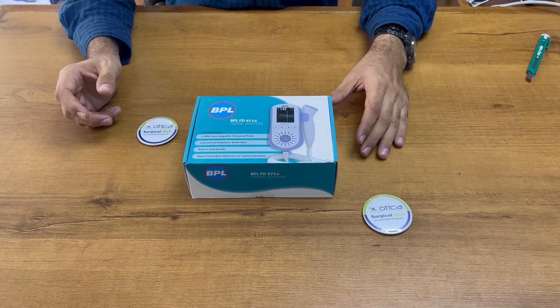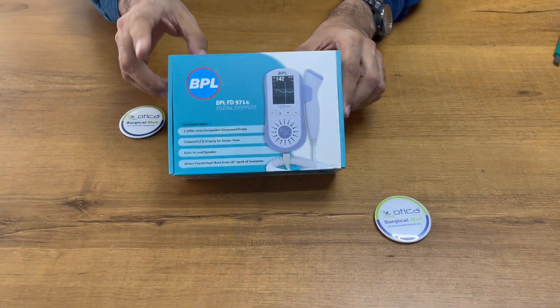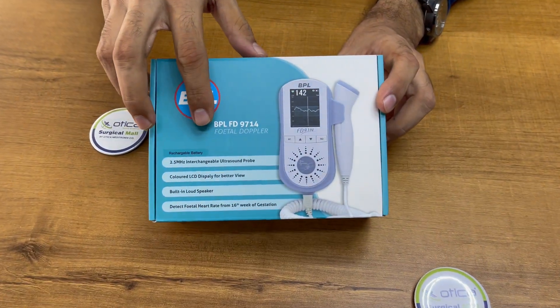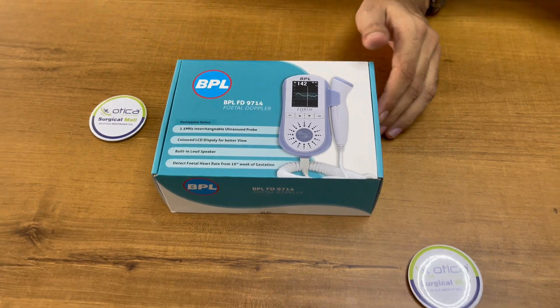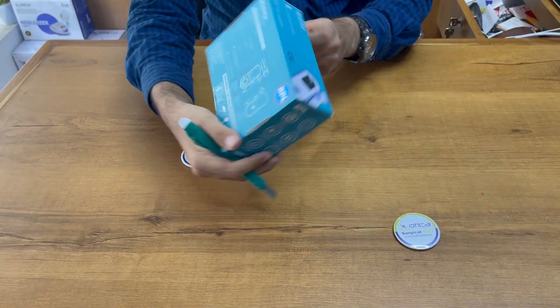Hello friends, welcome to Vatica Meditronics Company. Today we are going to demonstrate and unbox the BPL Fetal Doppler. The model number is 9714. This is the latest model launched by BPL Company. You can see 360 degrees they have given everything properly.